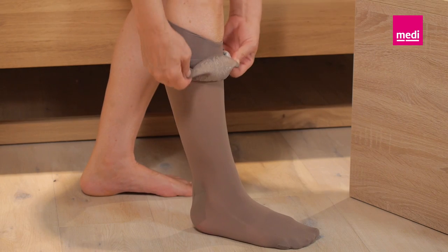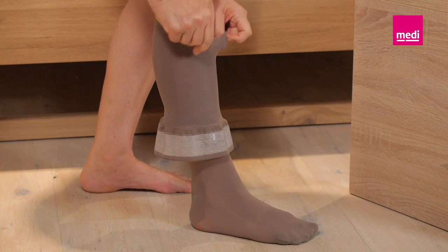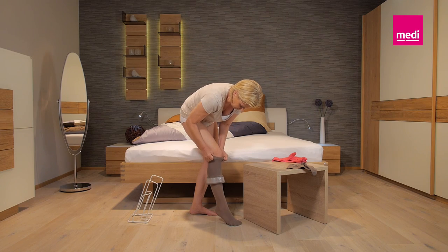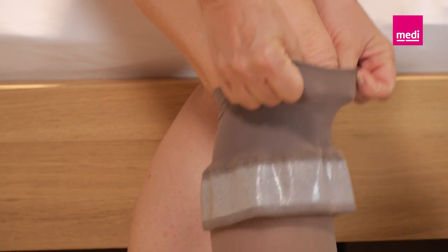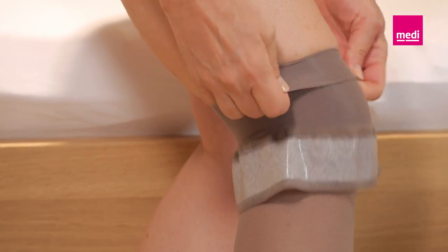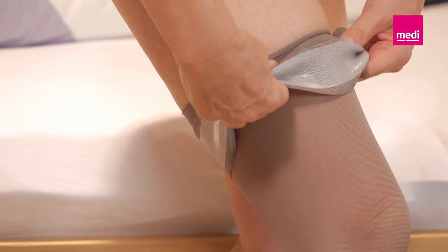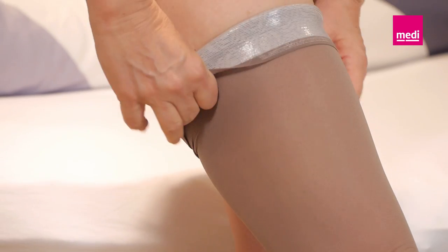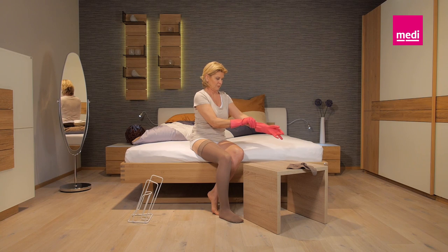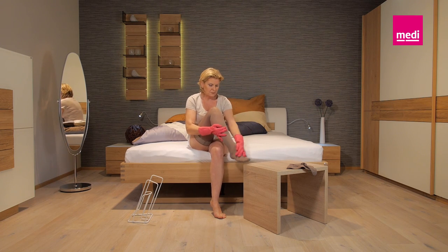Please note, if you have large calves, you only need to pull the Medi-Butler up to the middle of your calf. You can now grasp the material and slide it up over your knee. Now, put the stocking on completely. A tip for your thigh-length stocking: hold the material when putting the stocking on. This protects the seam in the top band. Finally, smooth the material evenly over your whole leg from the heel up to the top of the cuff.